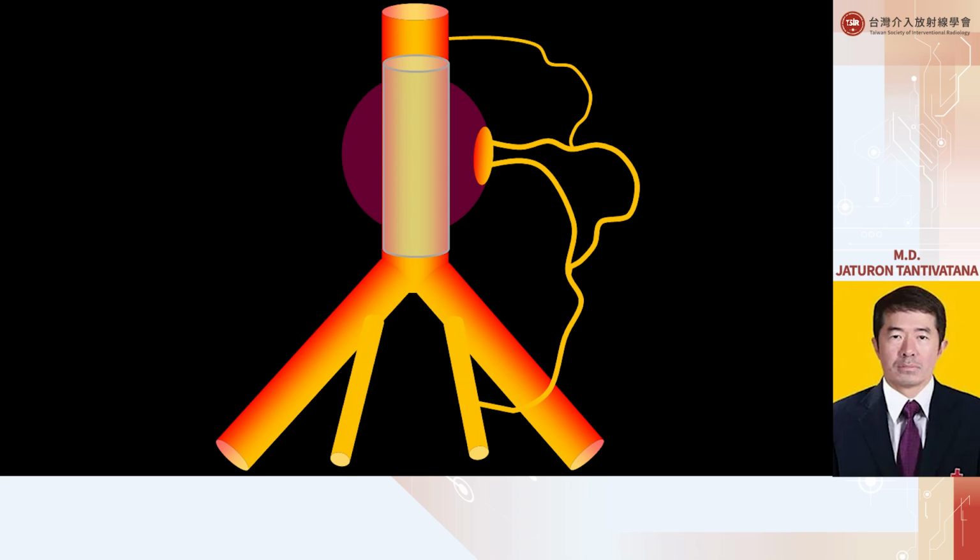Another application, which was developed recently, three or four years ago, is this example after treatment of an aortic aneurysm with an aortic stent graft. One of the common problems is the type 2 endoleak, which arises because of the residual cavity in the aneurysm that is fed by retrograde feeding from the segmental branches, lumbar arteries, or even from the hypogastric arteries, internal iliac arteries, with anastomosis backward into the cavity of the aneurysm, which sometimes is still patent.